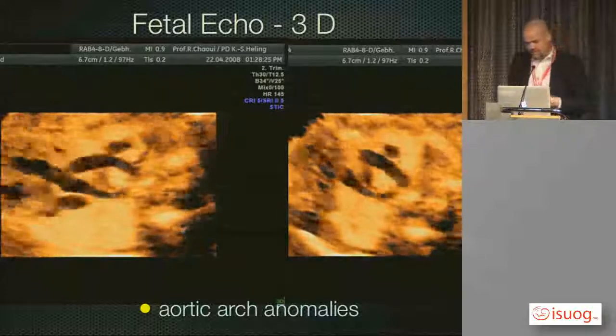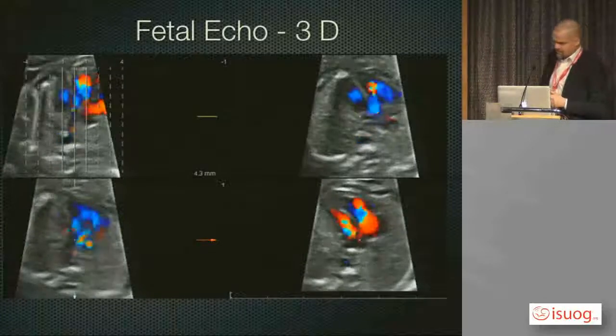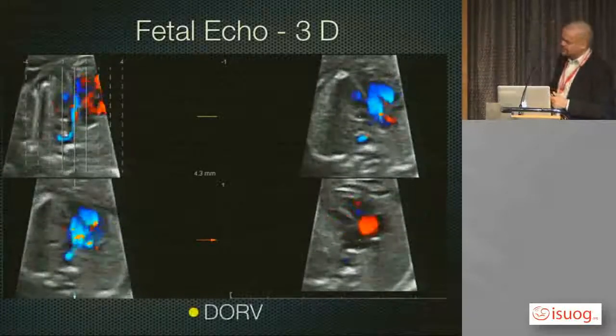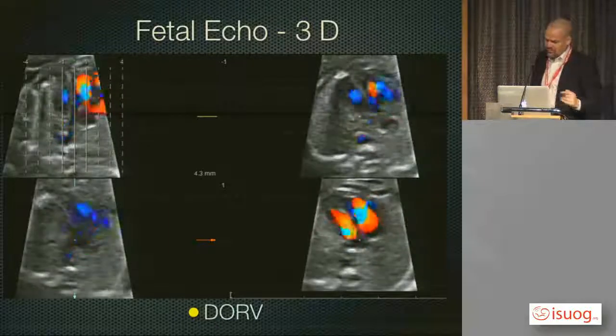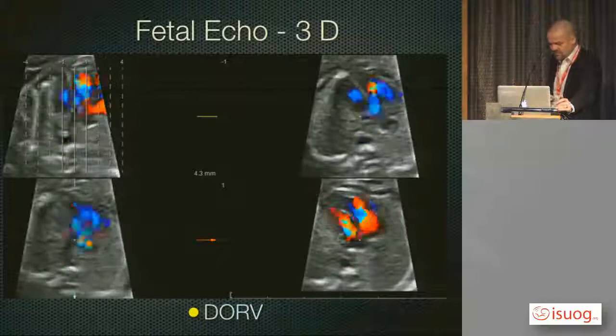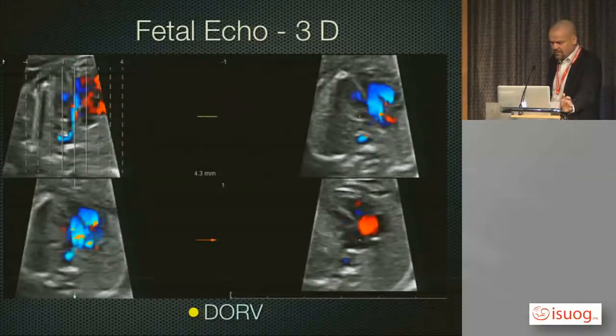And we use multiplanar imaging also for teaching. Often people have problems understanding heart defects which have a normal four-chamber view but abnormal great vessels, and clearly you can see in red normal diastolic filling of the ventricles, but when you go to the outflow tract you see parallel course of the vessels, both coming from the right side, double outlet right ventricle.